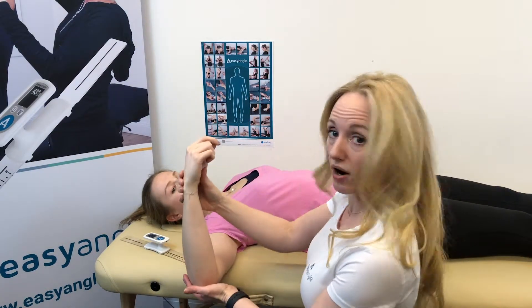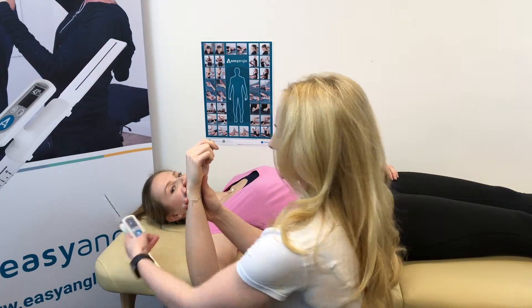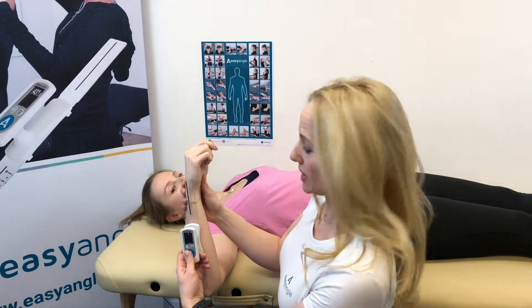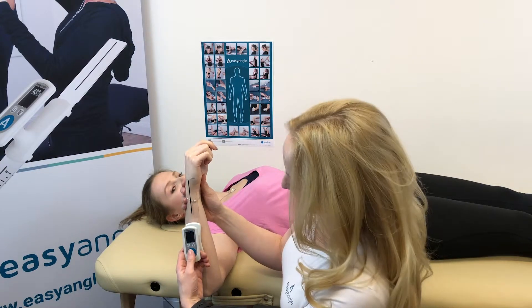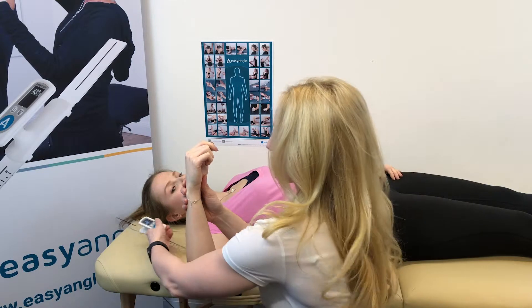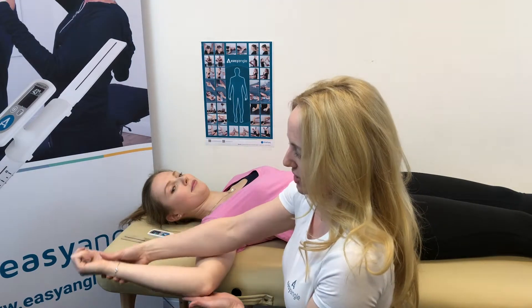We take the patient's arm out, and then with the device we align it with the ulnar and press the button to start the measurement. We can then place it to one side and have the patient come to their maximum range of motion.